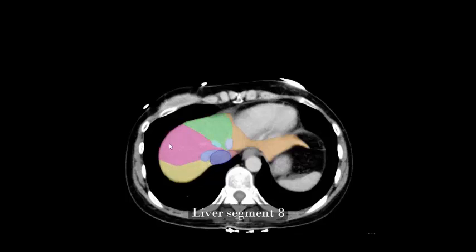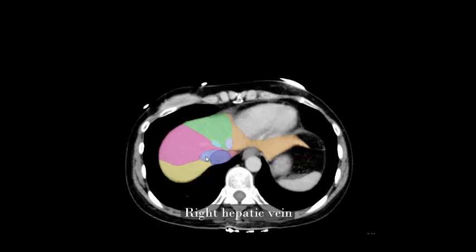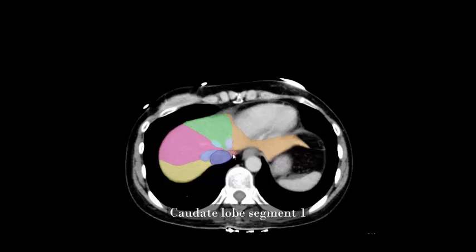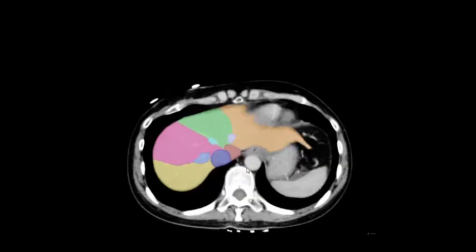Liver segment 8, liver segment 4a, liver segment 2, inferior vena cava, right hepatic vein, middle hepatic vein, left hepatic vein, caudate lobe segment 1, liver segment 7.